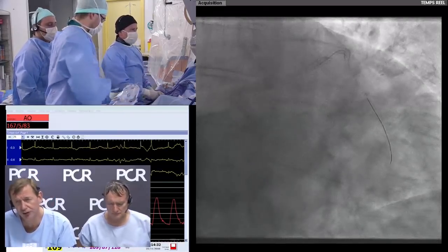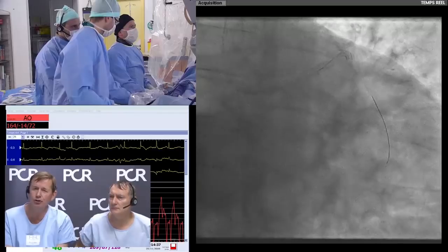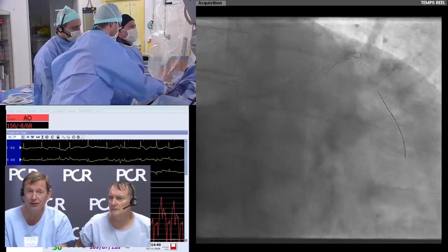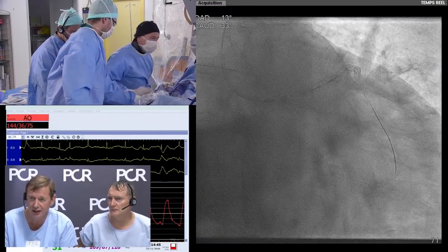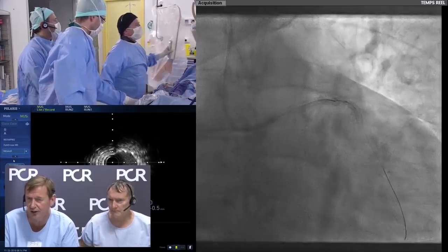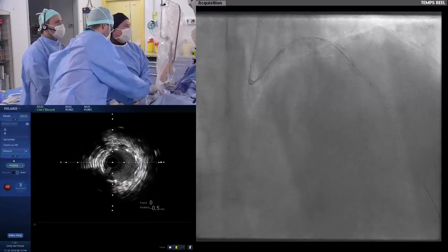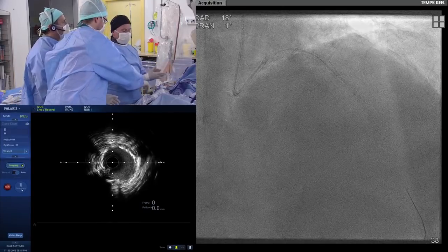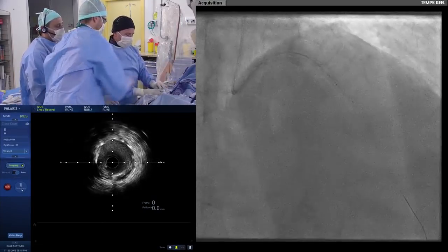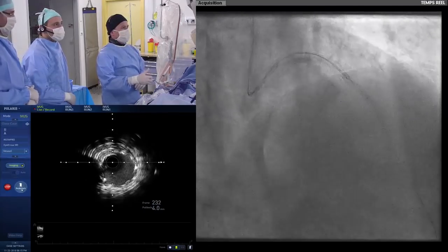Sorry. We've had a question: let's say you thought you had prepared the lesion, and then you put your stent in, and in fact it turns out there's still quite marked indentation. What action might you take if the stent didn't fully deploy in a calcified lesion because of lack of preparation? Bad luck. Yeah, that's bad luck, of course, but it's a bad luck that we could always anticipate, by doing adequate plaque modification. Well, one possibility is to use high pressure balloons, but as you said, the risk is always to have a vessel rupture even behind the stent struts. That can always occur.